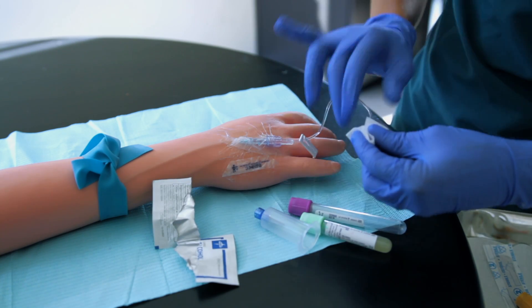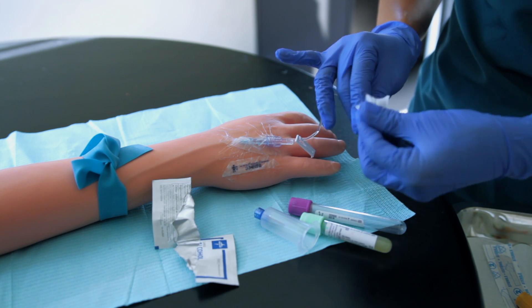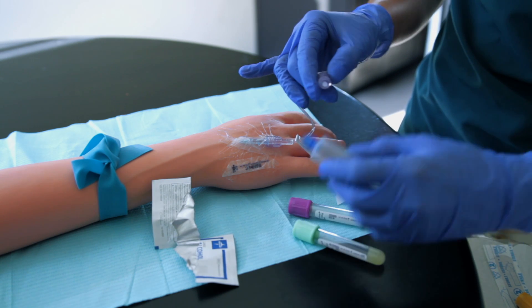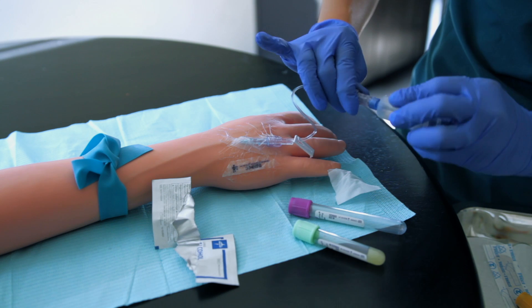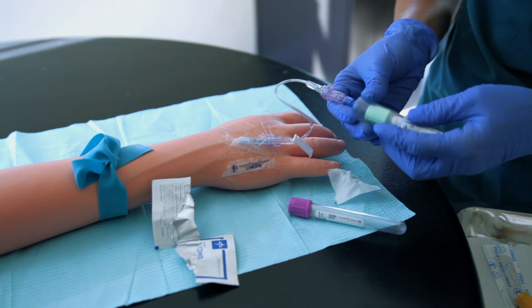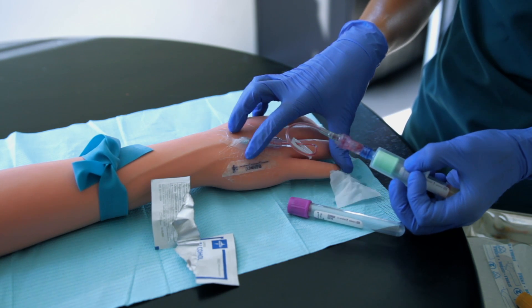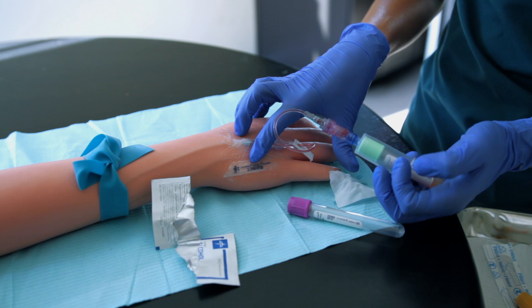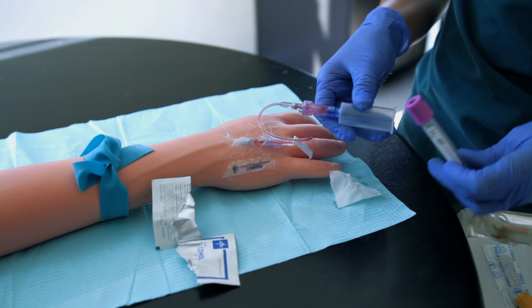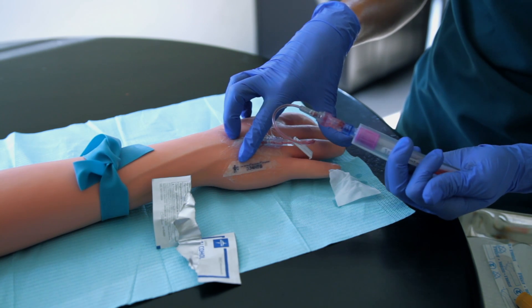I'm going to clean the site. I've already flushed it, and I'm also going to do a waste. Once the site is clean and dry, I'm applying my vacutainer. Then I apply my tube — sometimes you have to pull back on the vein a little. There's my waste.